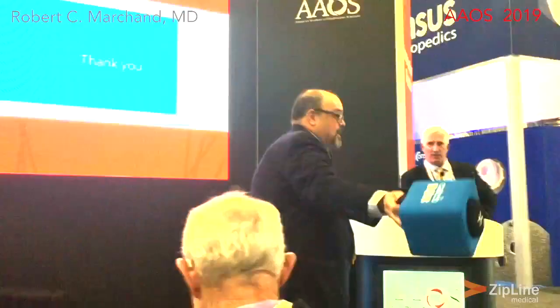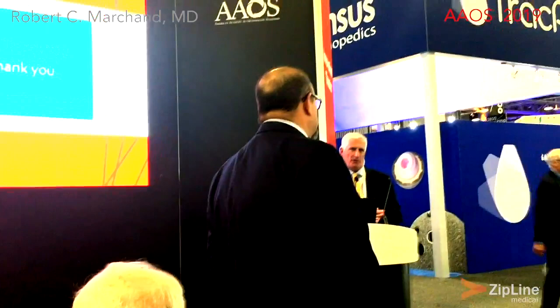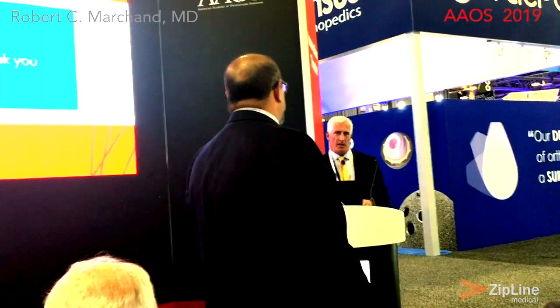So the sequence of the evolution of wound care was staples and sutures. Then I went to benzoin and steri-strips with a subcuticular closure. This is many years ago. That was torture. I got more blisters with benzoin and steri-strips. And that was terrible.